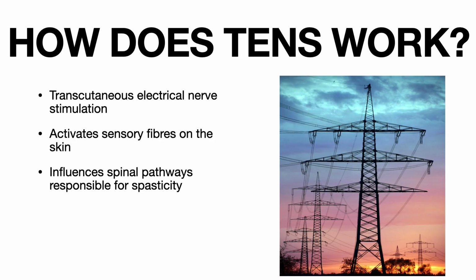So how does TENS work? TENS stands for transcutaneous electrical nerve stimulation. And it involves the application of electrical current across the skin to activate sensory fibers on the skin.